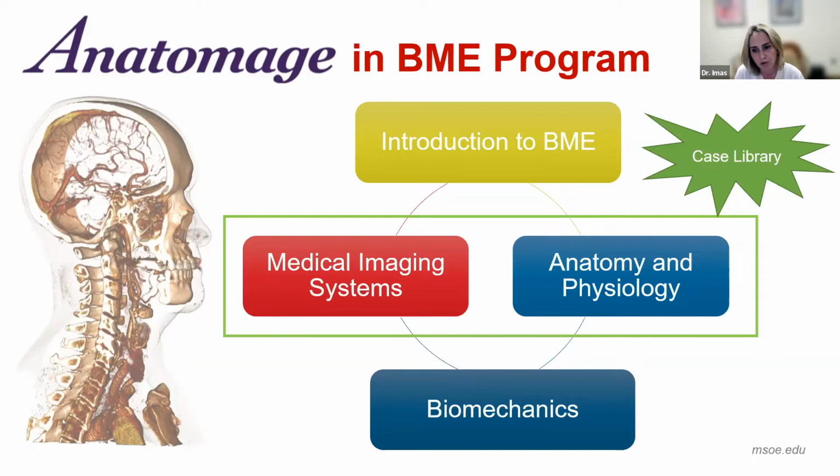It's really centered around anatomy and physiology concepts presented in the context of medical images. What would anatomical structures look like in medical images? What would the function look like, let's say, in four-dimensional images taken as a function of time, so that you can visualize function as well? So as you can imagine, the case library comes in very, very handy.